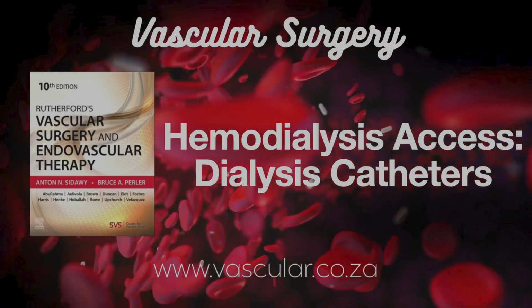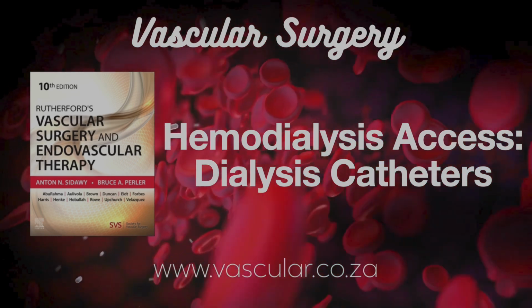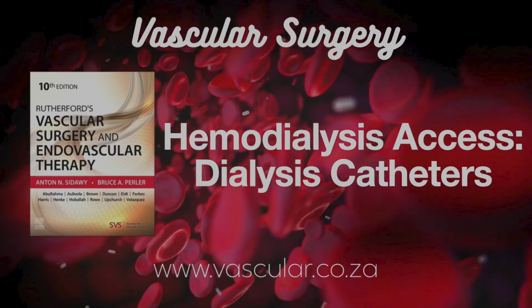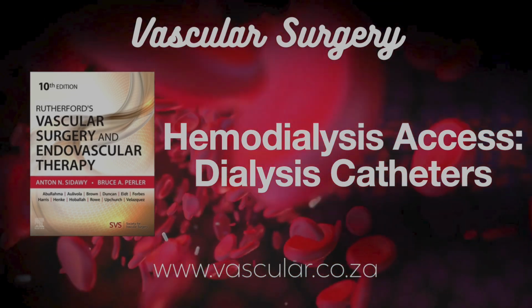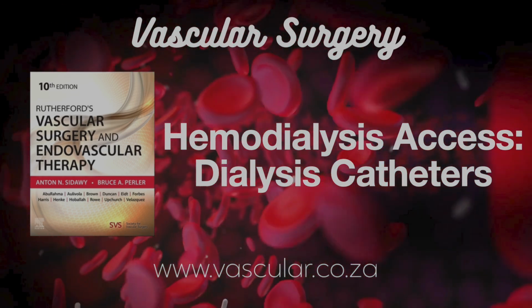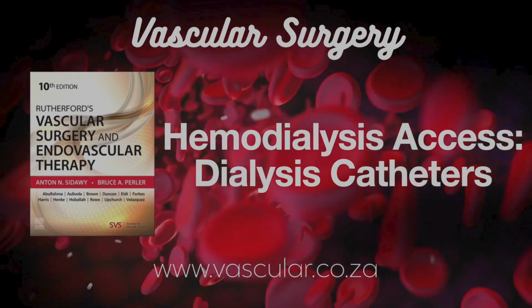Precisely, spacing them out. The third type is, well, pretty straightforward. The dual catheter design. You literally insert two separate single lumen catheters, often in slightly different spots. Okay, two distinct catheters. And the last one? The symmetric tip. Here, the arterial and venous limbs, or tips, are the same length. Wow, quite a few different approaches. Has one of these designs emerged as the clear winner? Like, is there a best one?